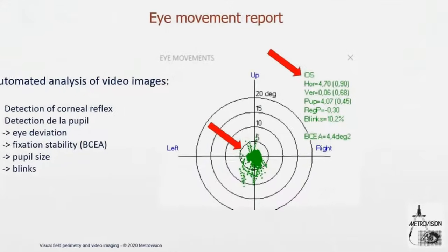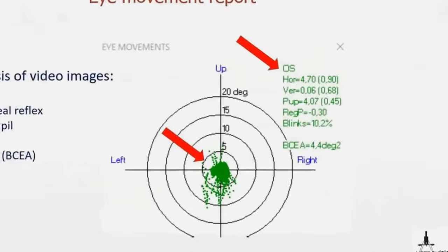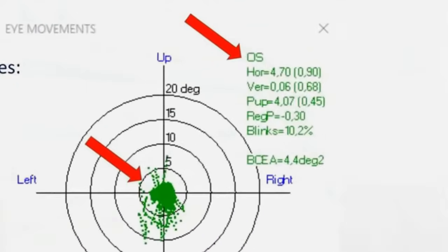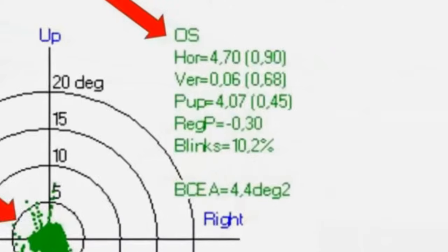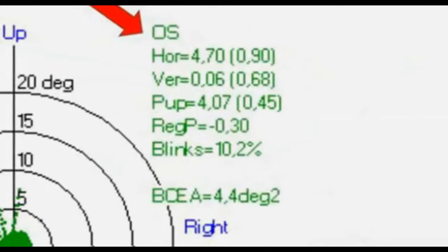Here you see some quantification of this cloud. You have what's called typically the BCEA. It's something used in microperimetry, which represents the surface area of fixation throughout the entire exam. So typically here we see that during the exam, the fixation has been over an area of 4.4 square degrees.